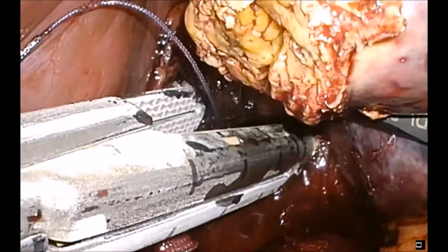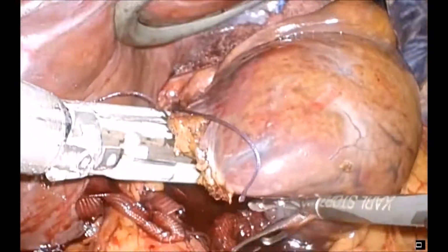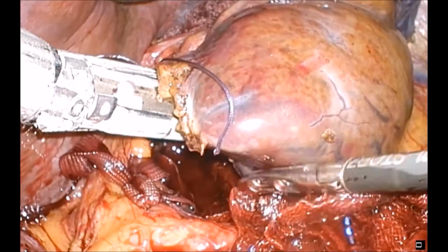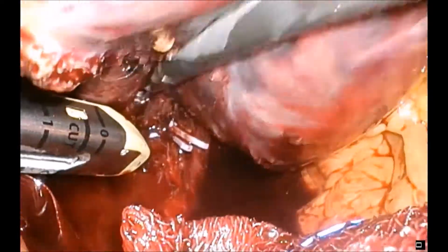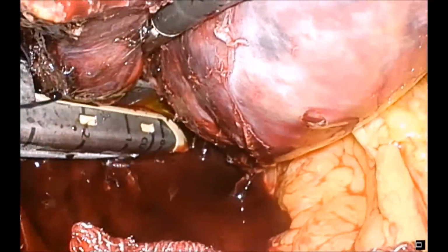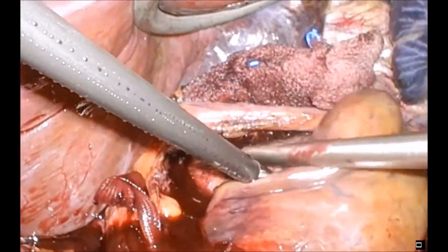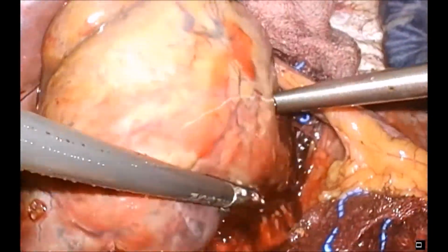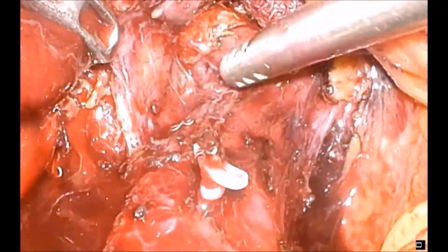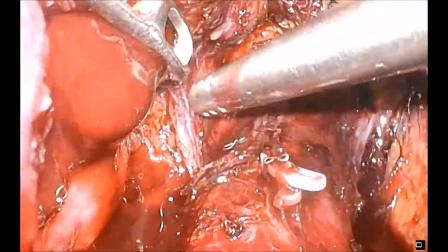And here a stapler was used, even though it's not much of a pedicle there still may be a reasonable blood vessel inside this piece of tissue. The Raytec is of course pulled out of the way, and it's crucial at this point that no clips be caught inside the stapler, as that could cause a misfire of the stapler and lead to the knife firing without the staples working, which can be disastrous from a bleeding standpoint.